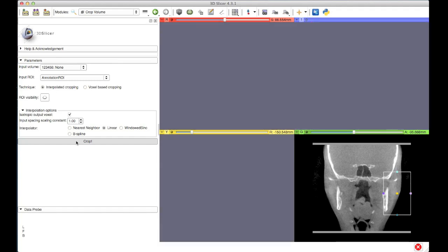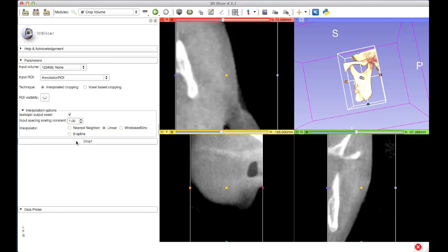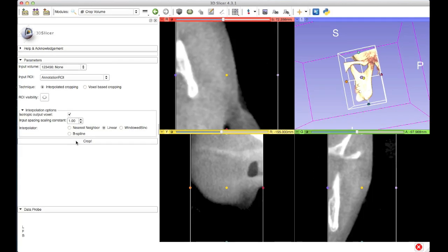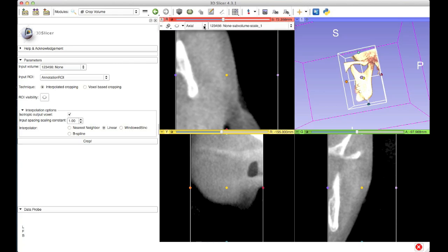You can see that the input volume is the cone beam CT, and the input ROI is automatically selected to be the annotation ROI — so that's perfect. This is the ROI that I just created in the volume rendering module, and now I'm using it to crop. So I'll hit the crop button, and when I do that a new volume is created that only contains that region of interest. So now I've truly cropped down my cone beam CT — this new volume is called the sub volume.